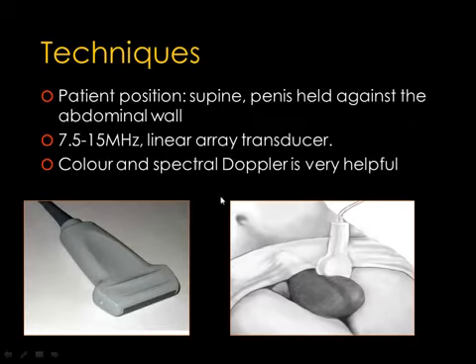Scanning techniques. The patient is supine. The penis is held by the patient against the abdominal wall. The patient is asked to place his legs close together to provide support for the scrotum, or a rolled towel might be put between the two legs.